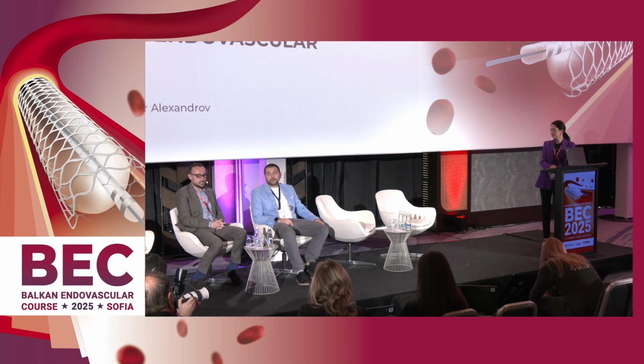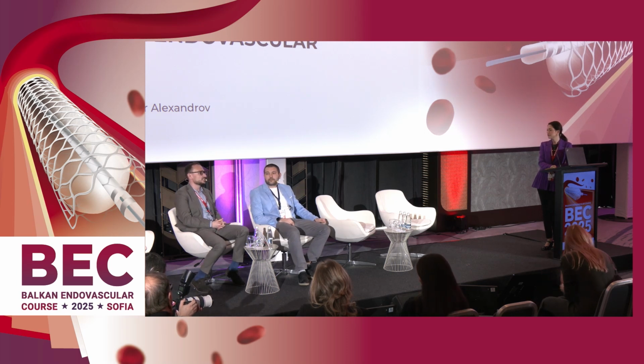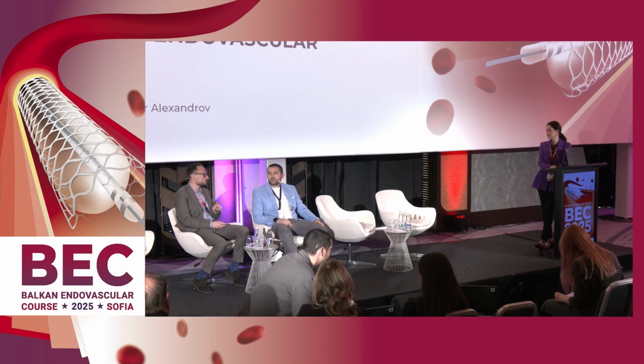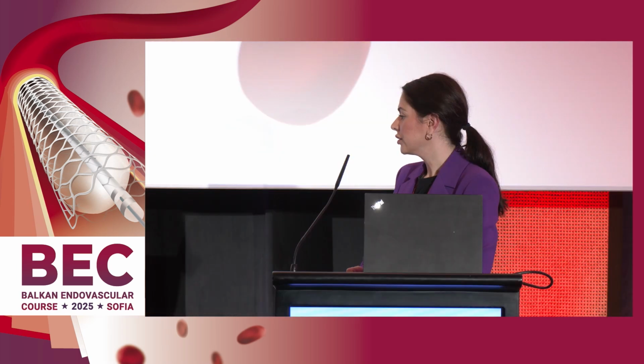Okay. And my other question is, for example, if you have a patient with severe stenotic lesions of all 3 vessels, how many arteries do you treat? Just one, or all 3, or what do you prefer? What's your protocol? The difference is whether the patient has good collateral blood flow for the celiac trunk or maybe for the inferior mesenteric artery. In the third case, the celiac trunk didn't have a collateral, and the second step was to recanalize the celiac trunk.